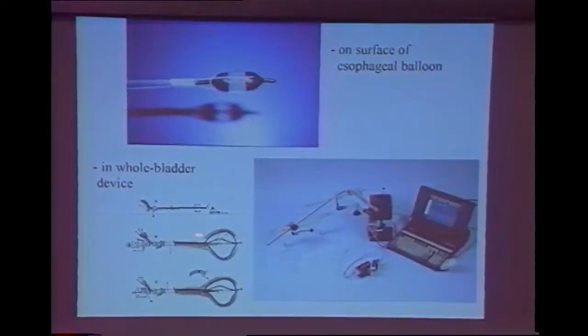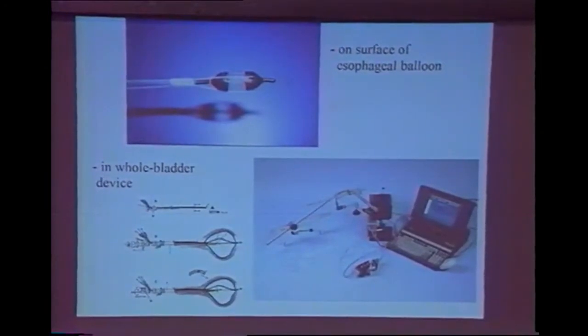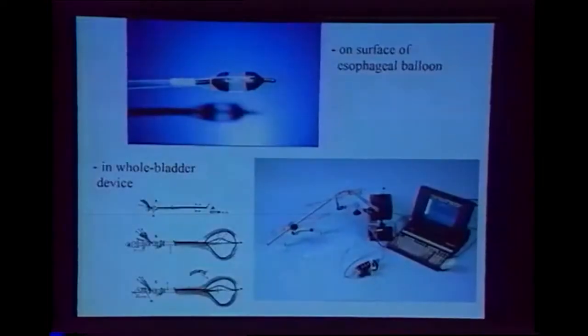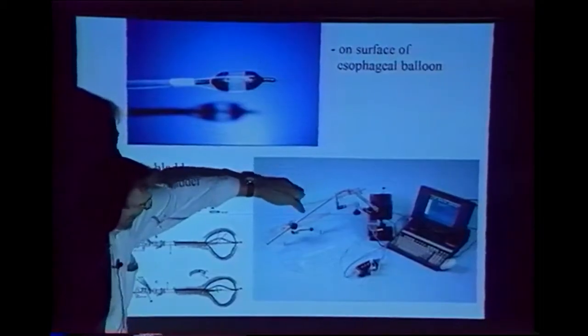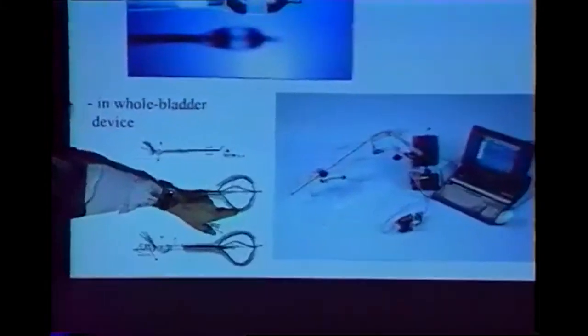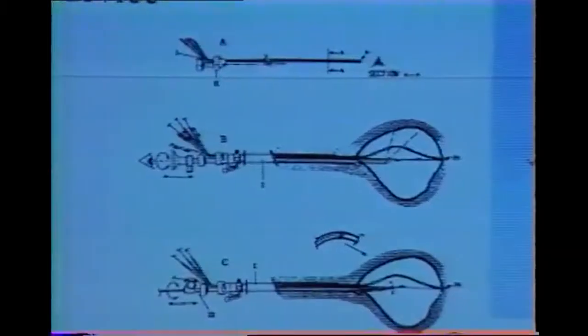This was a nice system developed in the Netherlands for bladder, where through the cystoscope, you had first of all a diffusing tip to deliver the light, and then this is very clear here, this sort of wire cage, and these are 3 catheters, and one of these diffusing optical fibers is inside each catheter, and then it comes out and it's connected to the dosimetry device.